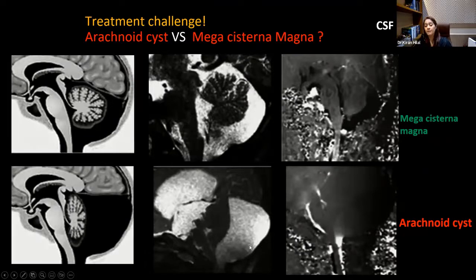space there. But if you have again a similar cystic space, and you see all the CSF spaces are white here, here, here, and this cyst is not showing any continuation with the rest of them, that means this arachnoid cyst is not showing the continuation because it's not a normal CSF duplication space.